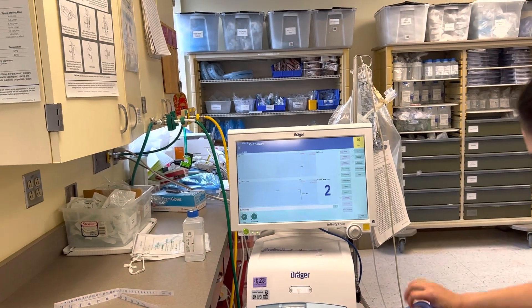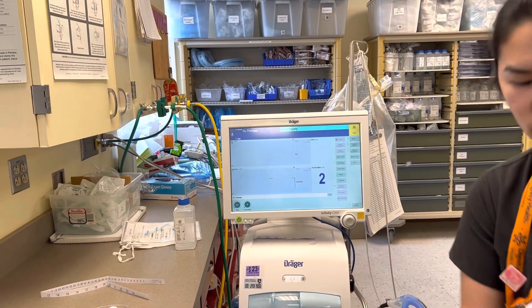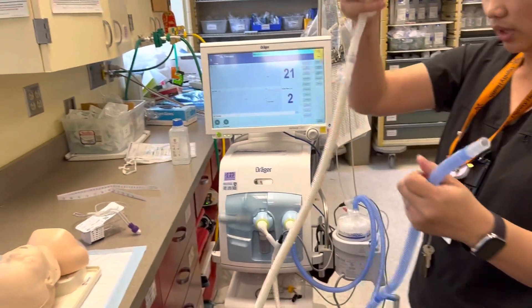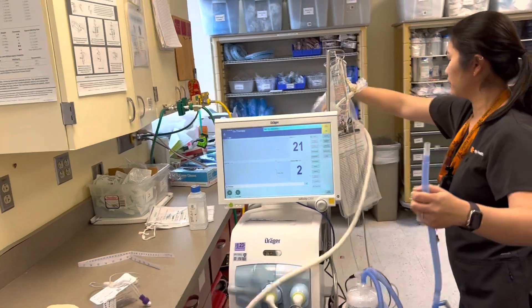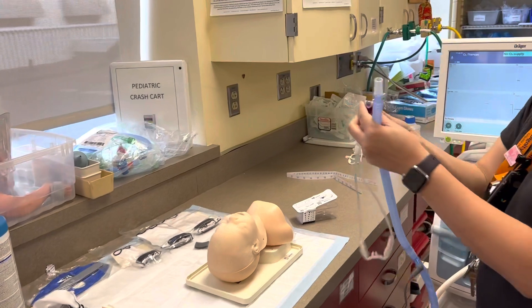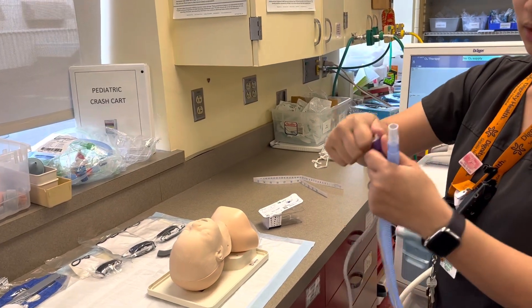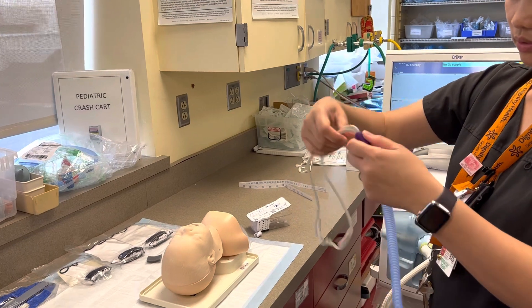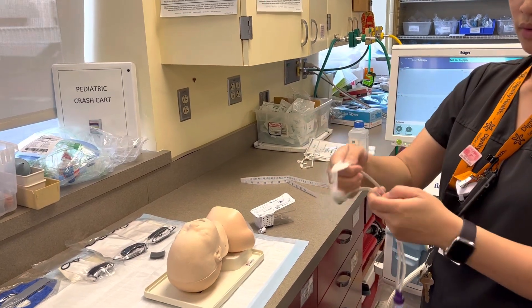Follow the inspiratory limb to the blue connector. Go ahead and hand this to the back. Grab the nasal cannula. Take the white adapter out and connect it from the cannula.